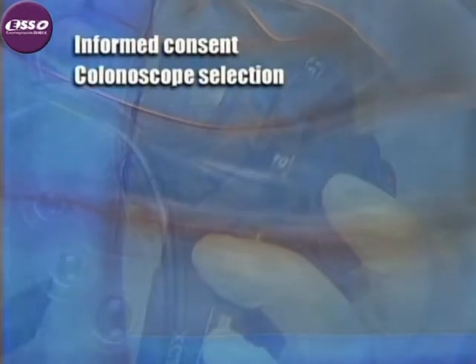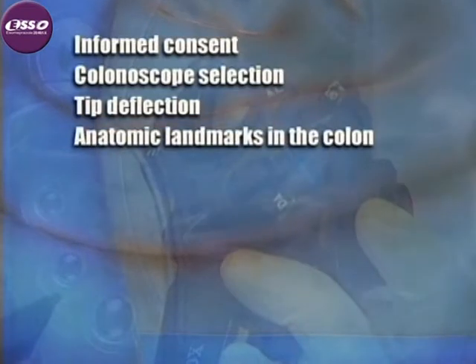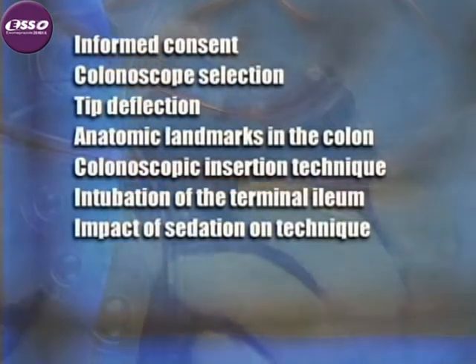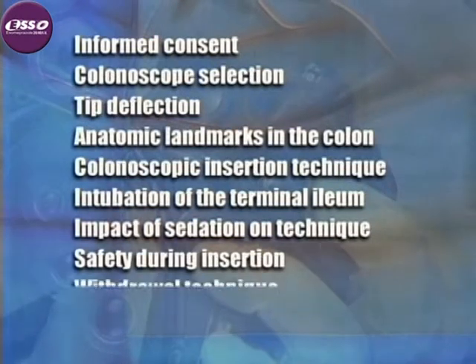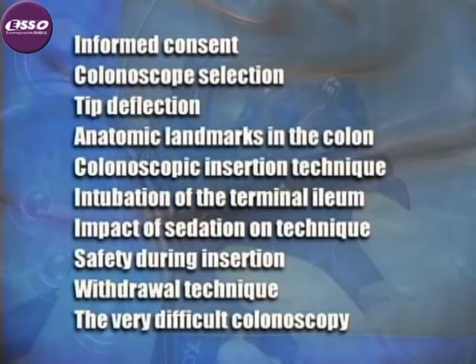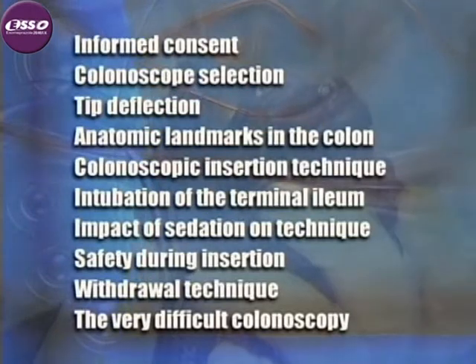The content of the video includes a discussion of informed consent, selecting the type of colonoscope, understanding tip deflection, anatomic landmarks in the colon, colonoscopic insertion technique, intubation of the terminal ileum, impact of sedation on technique, maintaining safety during colonoscope insertion, withdrawal technique, and finally, the very difficult colonoscopy. You can view these sections in sequence or select from this menu. A separate DVD covers polypectomy technique.